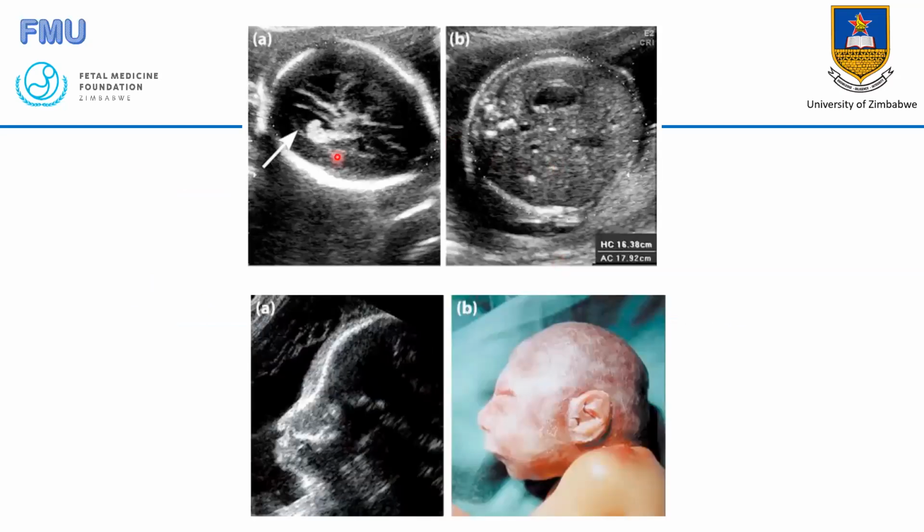So whenever you measure the head circumference, look at the comparison between the head circumference and the AC. From your scanning so far, you are now aware that it's only in the third trimester, at term, that the abdominal circumference approaches the head circumference, but the head circumference is always the bigger one, right? In a woman who is not at term, normally these structures come together for certain babies around 40 weeks. But before that, the head is always supposed to be bigger than the abdominal circumference. But of course, there are always exclusions, right?